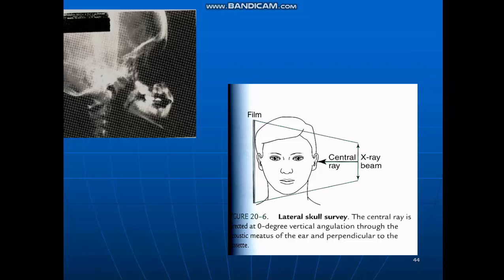Main indications are fractures of the cranium and cranial base, middle third facial fractures, to show possible downward and backward displacement of the maxilla, investigation of the frontal, sphenoidal and maxillary sinuses, conditions affecting the skull wall, particularly Paget disease, multiple myeloma, hyperparathyroidism, and conditions affecting the sella turcica, such as tumor of the pituitary gland in acromegaly.